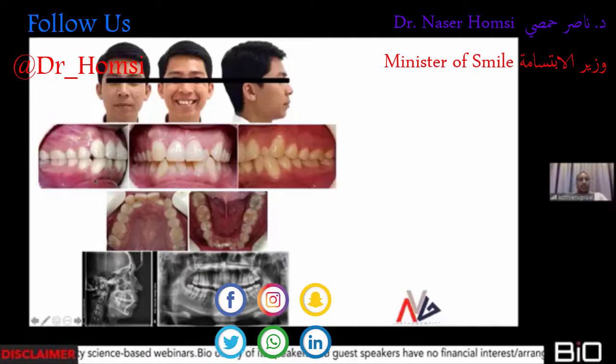The initial plan in this particular case was just extracting the 1/4 because I was under the impression that I would be able to open the space by extracting this. This was pretty easy by just placing an open coil spring, and I would be able to expand the lower arch, considering that they're pretty narrow from the word go.